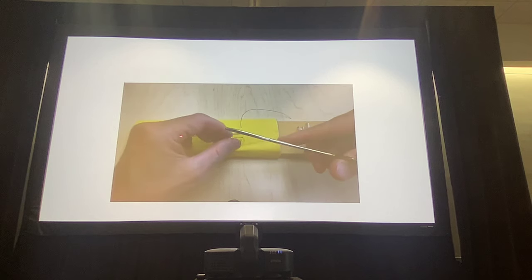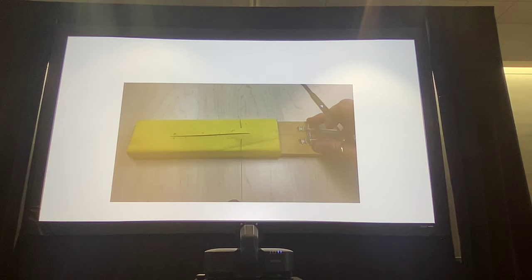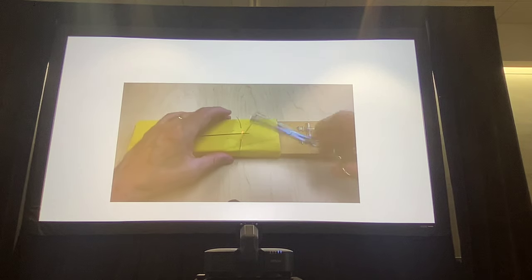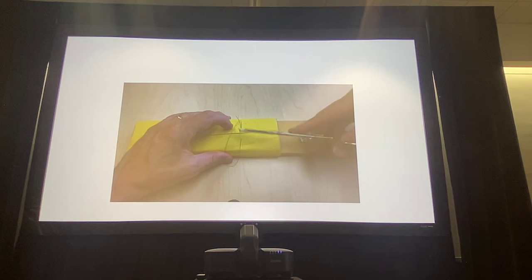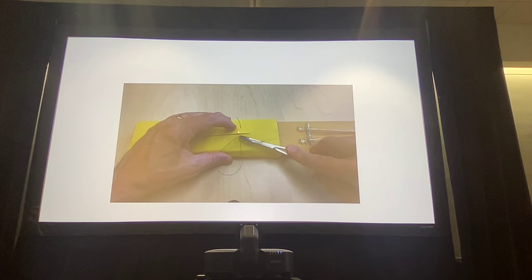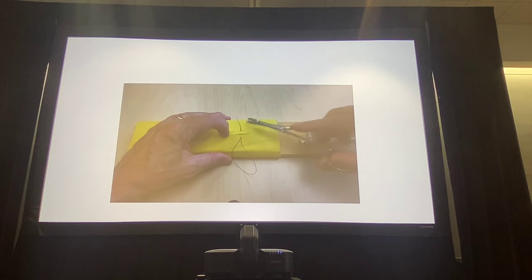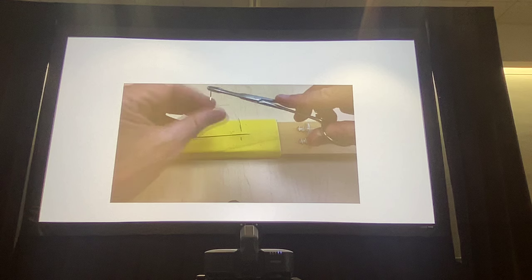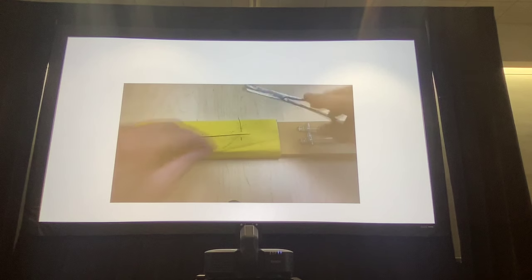Come across. Now you're going to reverse the needle. And instead of what we did before with horizontal, where we went next to it, you're going in front of it. See, it's in the same plane. You're going in front. That's why I want you to start farther out, so you have room to do this. And then you're going to exit, same plane, right in front of your original placement. There you go, like that. And then you tie the knot. Surgeon's throw, then square.